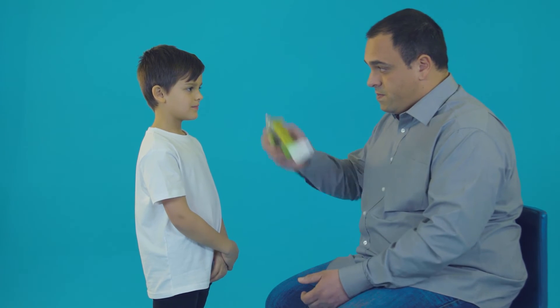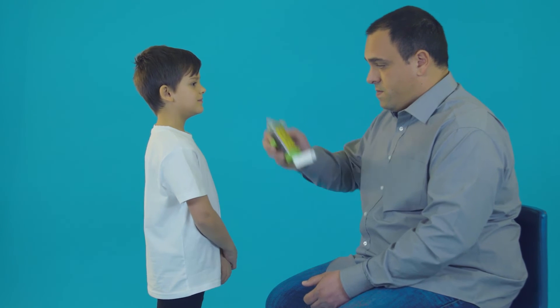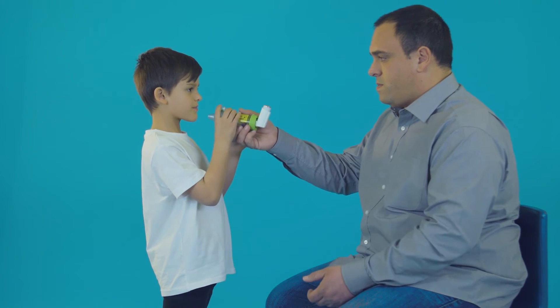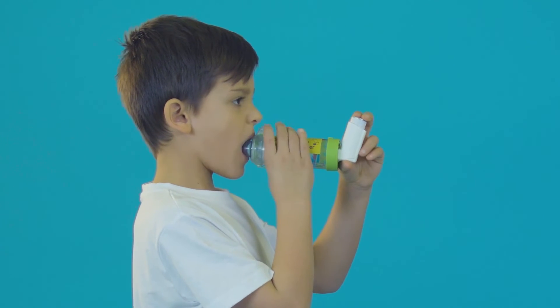Finally, if your child has been prescribed a second puff, with the inhaler and spacer away from their mouth, wait 30 seconds to a minute and shake the inhaler again. Then repeat the steps.